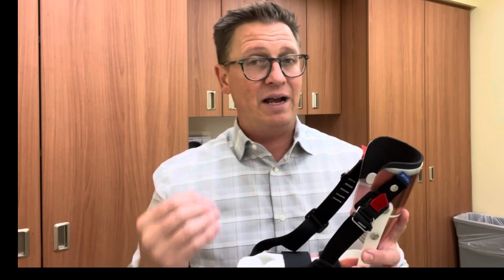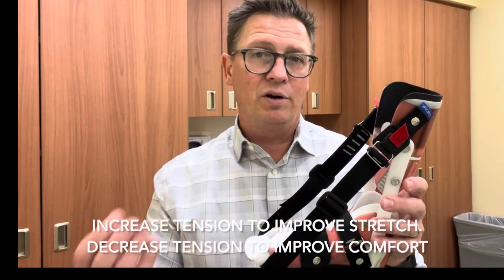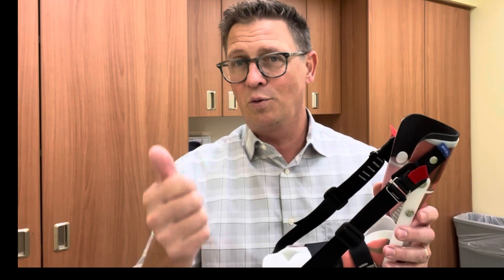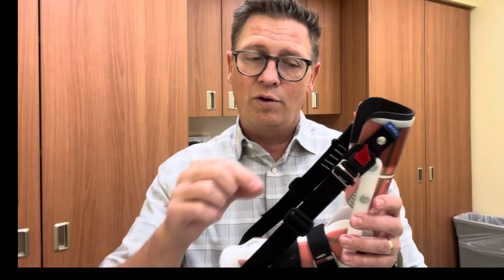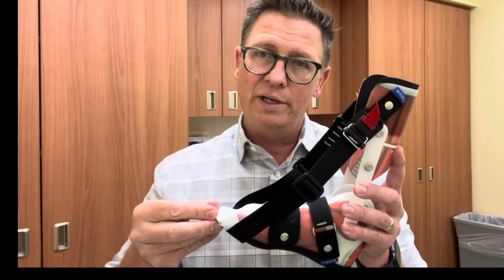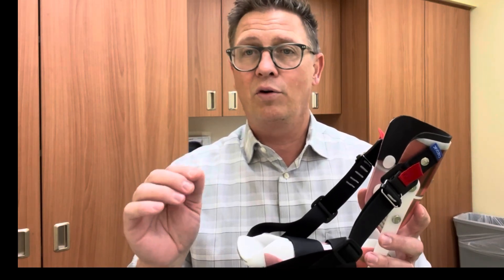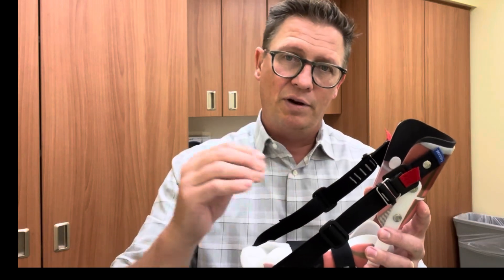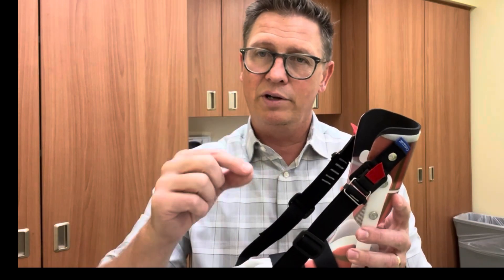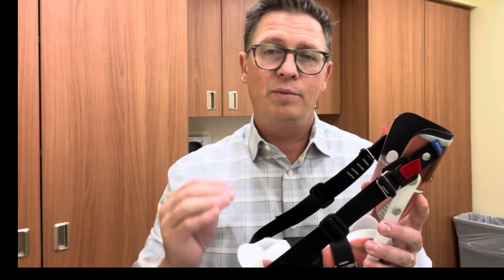You can adjust up to increase the tension or down to allow the foot to plantar flex just a little bit more, to ensure we're not pushing too hard and causing problems with sleep. The goal is, number one, to make sure these kids can sleep and tolerate wearing them, and then gradually increase the stretching tension just a little bit at a time. That's going to get better and better dorsiflexion at the ankle — but you can't go too fast or too aggressive, or they're going to have problems, hate it, and it won't work. You also can't leave it where it is. These marks are the best way I've found to increase that stretching tension just a little bit at a time, as long as it's being tolerated.